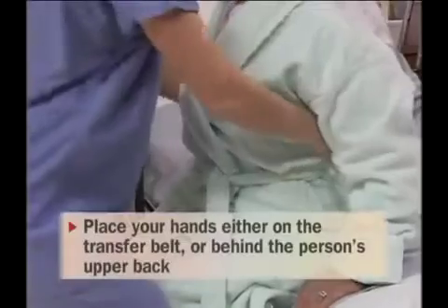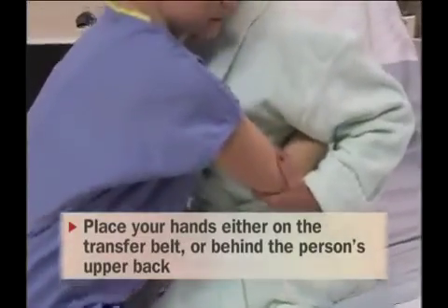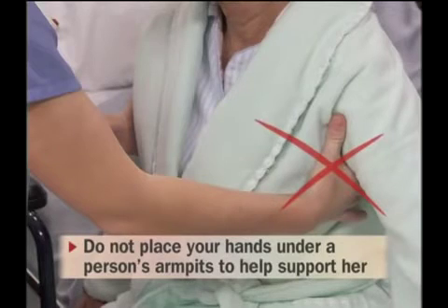To help support the person, place your hands either on the transfer belt or behind the person's upper back. Do not place your hands under a person's armpits to help support her, because if the person falls, she may be injured when you lift up as she is falling down.